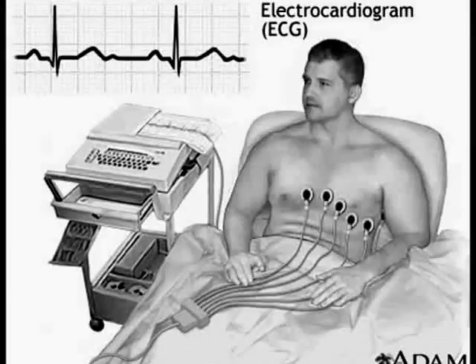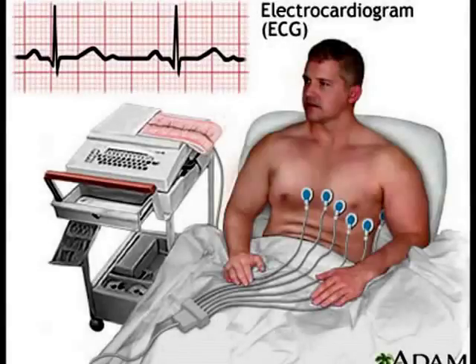Hi. Today we're going to be reviewing the electrocardiograph, which is the ECG. I want you guys to know that the ECG's main function is recording electrical activity of a large mass of atrial and ventricular cells as specific waveforms and complexes. So these electrical activities are observed via electrodes.